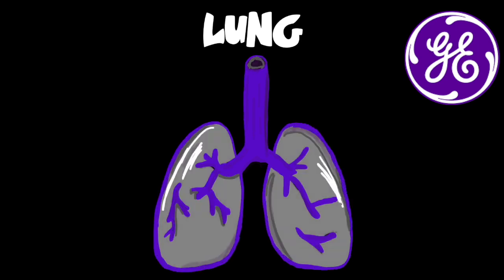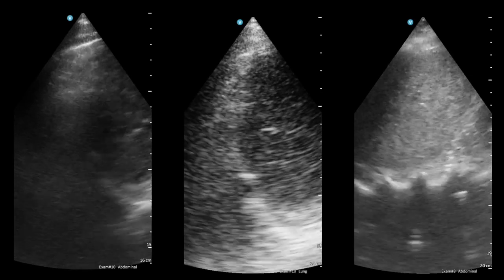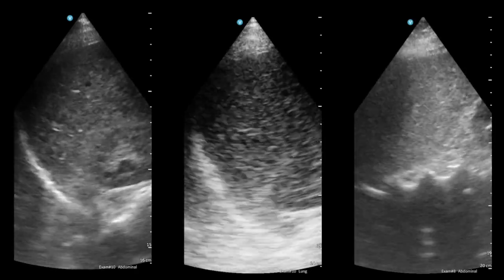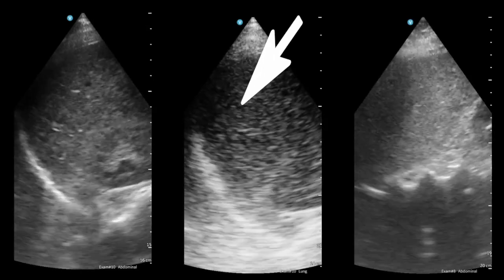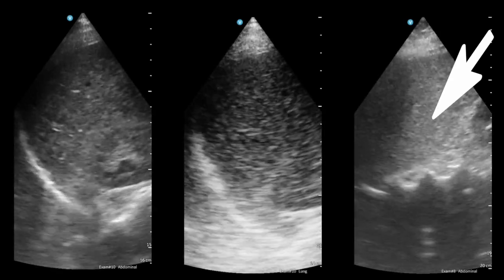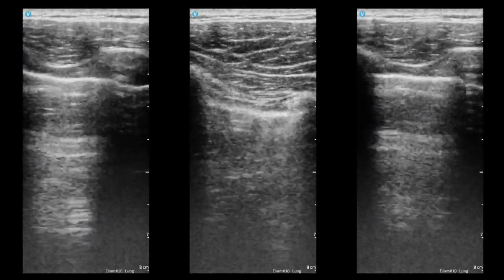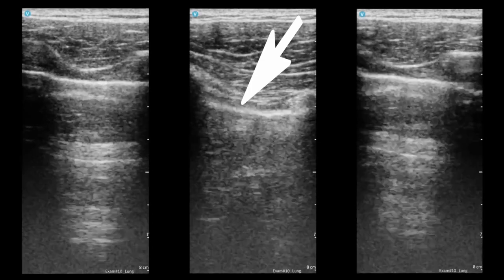What about lung? On the lung side, using the phased array probe — which is eminently good for lung ultrasound and also abdominal and partial VEXUS — you can see the right and left lung bases with a good lung curtain coming through. Then with a bit more depth going back into the spine showing the abdominal compartment and Morrison's pouch. Moving to the upper anterior points, some really good linear probe views showing A-line profiling with nice sliding pleura between the ribs, really crisp and easy to see.